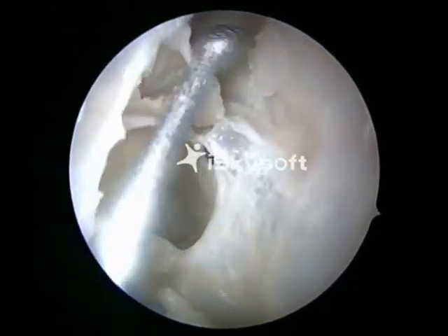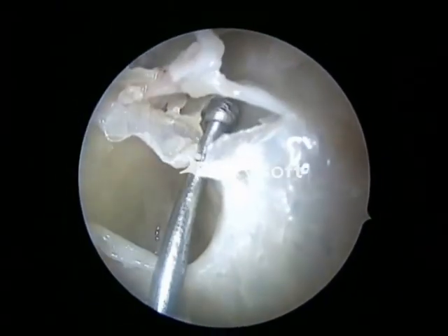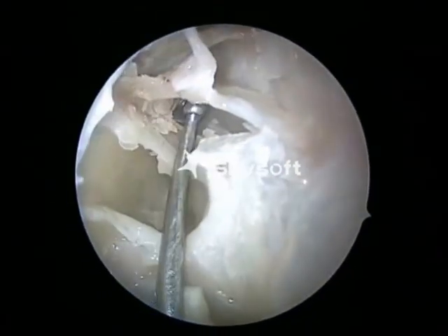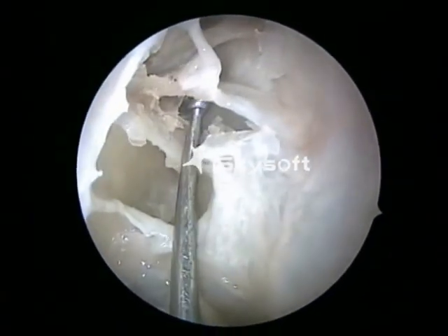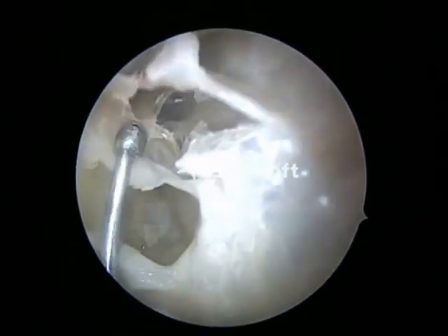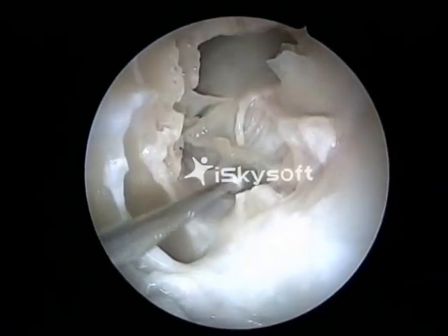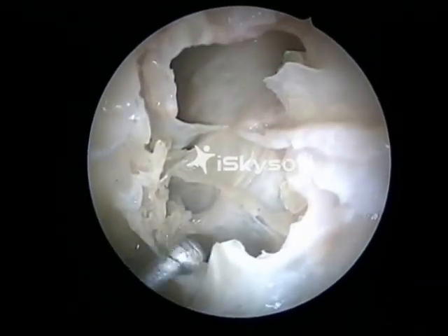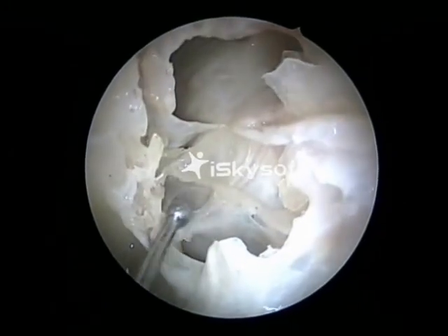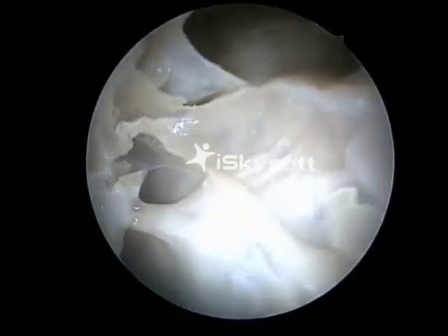We generally preserve the inferior wall of the bulla, and to do an anterior skull base dissection, we remove the suprabullar cell using a frontal ball probe. Once we remove the suprabullar cell, we are now able to see the anterior ethmoidal neurovascular bundle. That's the anterior neurovascular bundle.